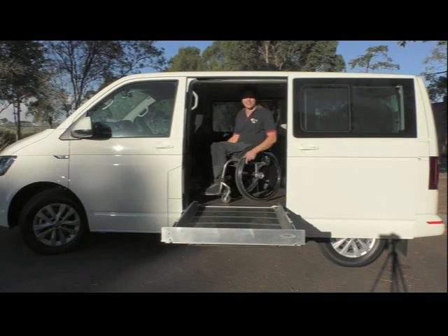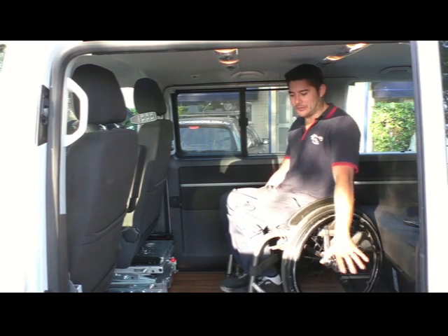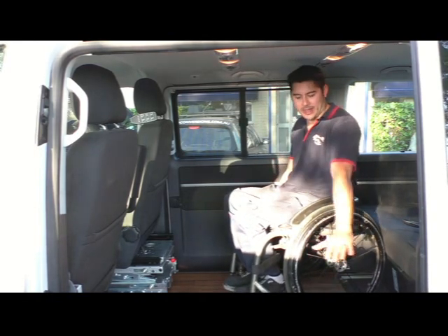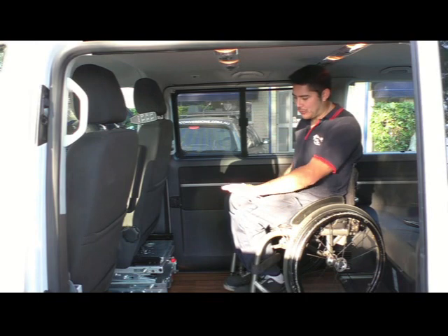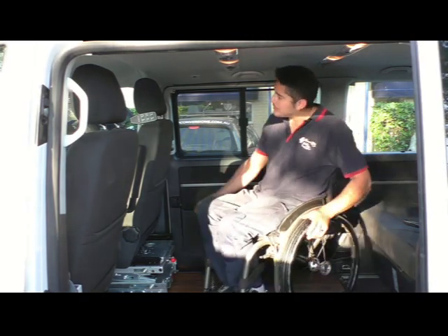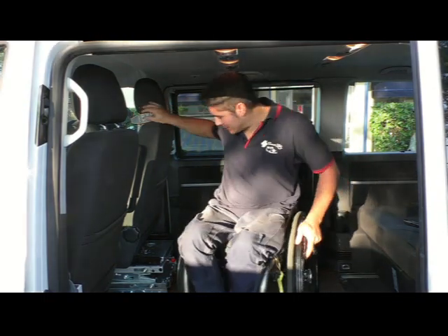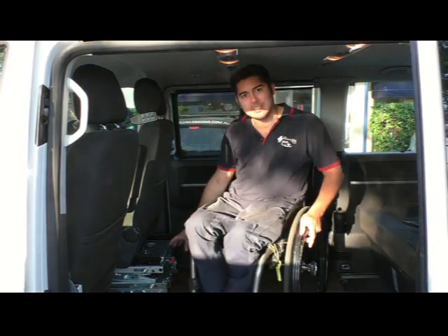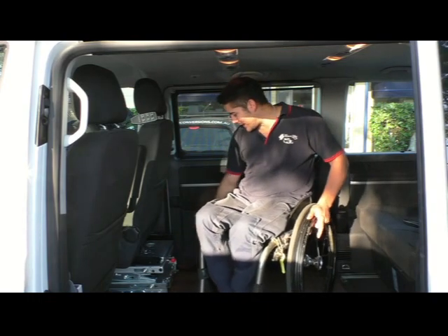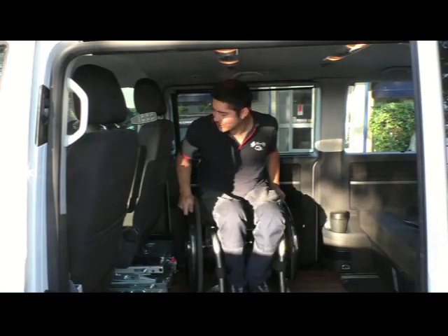So how's that for easy access? This is a Volkswagen T6 and we've just, to aid with the access, smoothed off all the flooring here and given it a bit of a wood grain finish. Now we'll talk about the Paravan six-way seat base. As you can see, this seat base here — we don't have any of the tracking on the ground, which gives you that extra bit of movement in the vehicle.